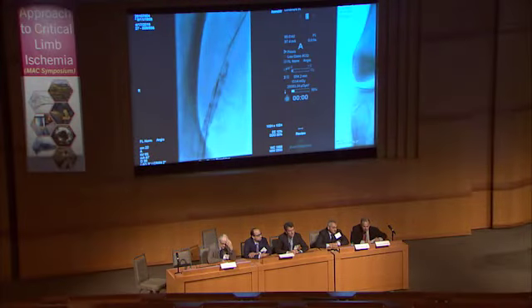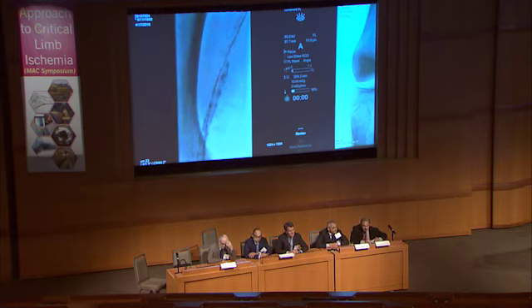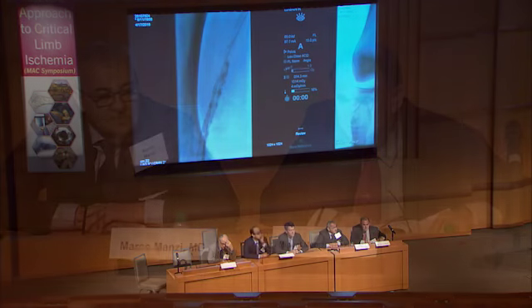So we deployed that stent. And I'm going to remove it now. Go ahead. So actually, the reason for using this stent is it has so much more resistance to elastic recoil, about 4.5 times the compression resistance of standard nitinol tubular stents. And as you could see in this case, where even a balloon at high pressure was having trouble opening, the stent does have a lumen through a good bit of it. But if you're going to post-dilate this, I would strongly urge you to go with a really short balloon.